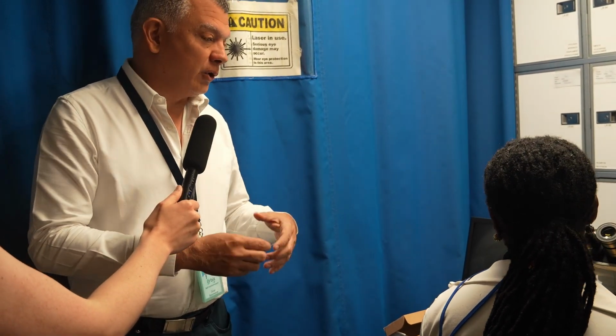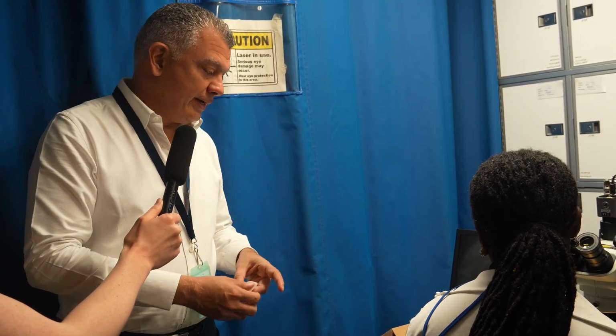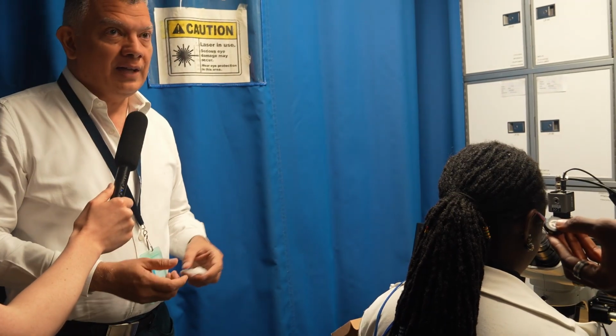And of course, with time, we're going to spend the entire day. I'm going to show her how to deal with the instruments, how to deal with the needle, because it's very small. It's thinner than a human hair. So it takes time, and the good thing is to do it here before we start doing it with patients. So it's safer for everybody, but especially for the patients.